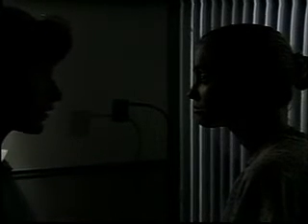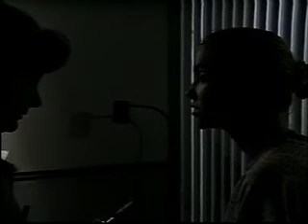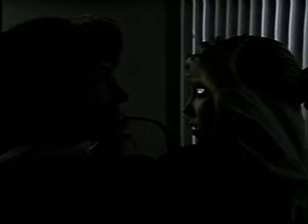I want you to look over my left shoulder. Using your left eye and left hand, examine the patient's left eye. From 15 inches away and 15 degrees lateral to the patient's line of vision, shine the light beam on the pupil. Locate the red reflex, which should appear as an orange glow in the pupil. Note any opacities that interrupt the red reflex.